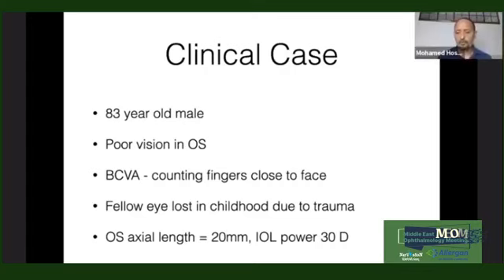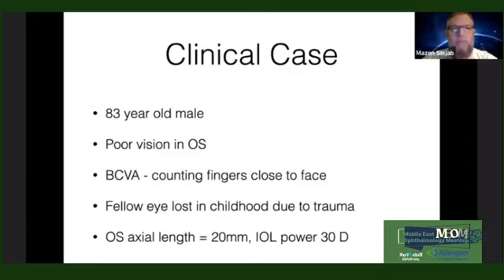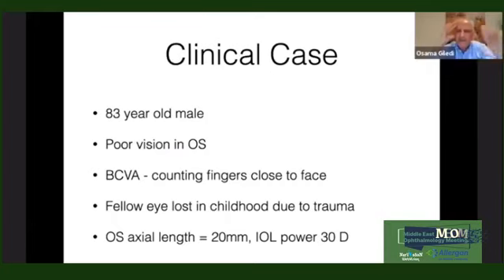Dr. Mazen, if you have any answer to Dr. Qudai's questions? Yeah, I tend to choose the dispersive and the BSS Plus, just because of the weak endothelial cells. It will be treated the same as someone who had Guttata and Fuchs. So it's the same principle, and we're going to discuss that at one slide. But I think this is a different pathology. To assume that everyone who had a herpetic corneal disease has a weak endothelium, I think it's an overkill.